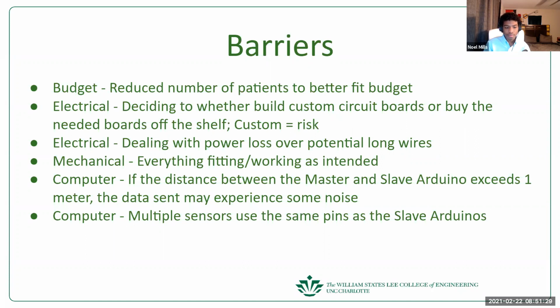Sure. And you've got opportunities for good cables, maybe ones that have more grounding and insulation and things like that. Yes. Yeah. And you've got the ability to check for the integrity of the data, like you know how much data you're supposed to get back. If you didn't get it, you ask for it again or do something, right? Yes. Yeah. I think that's a pretty low risk then. And if you say it's not bad until 9 meters and we're talking 1 meter now, it's good.